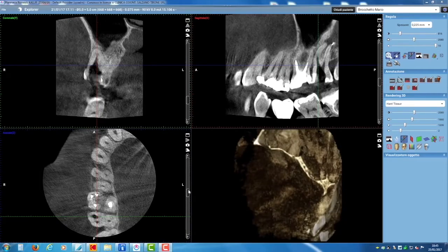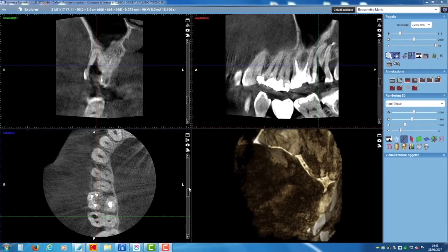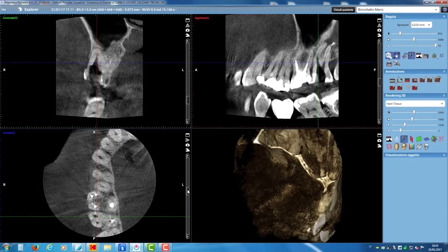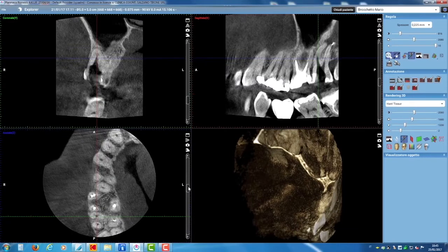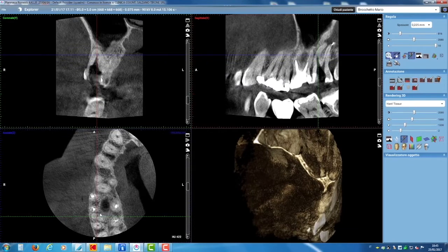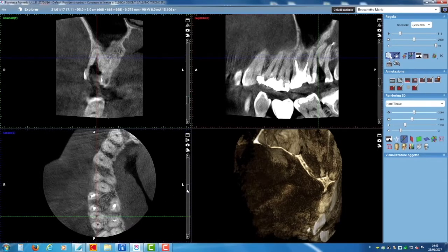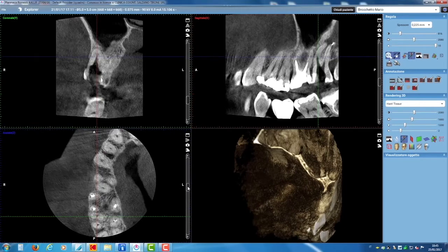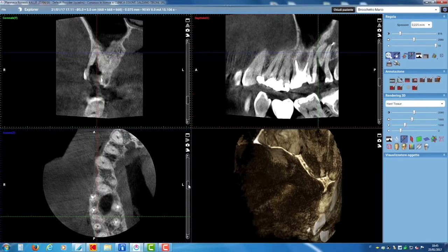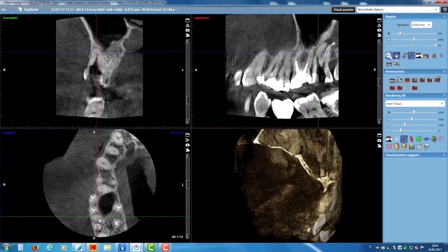Let's examine our cone beam. In this area right here we can see the little perforation that was made. Probably it's so small that its exit is not visible at all. Here you see the small pit I created in the attempt to find the canal. You can see that while moving forward in the apical direction, I detected a small black spot again — it's the canal that becomes more visible as you go towards the apex.